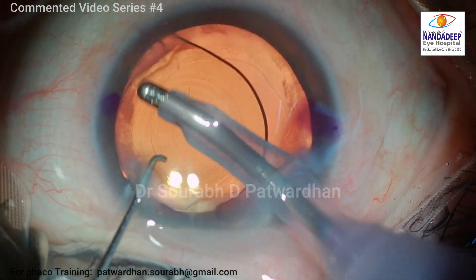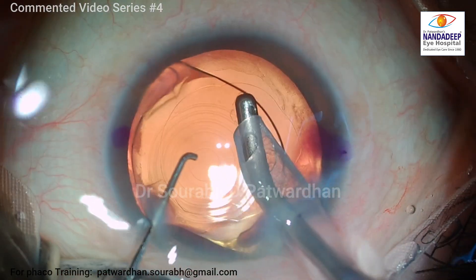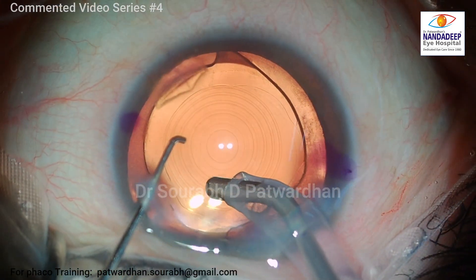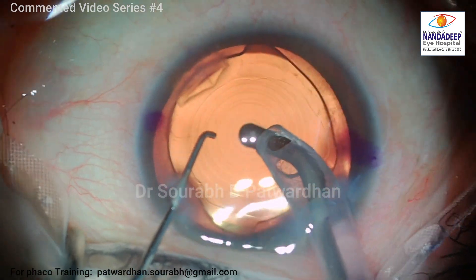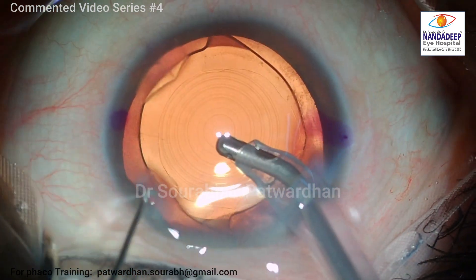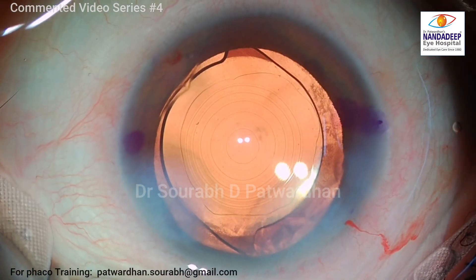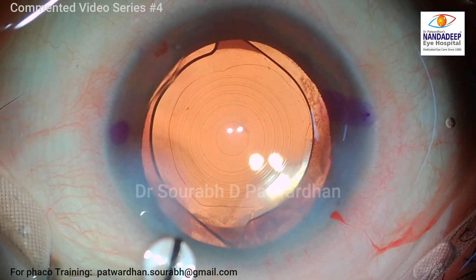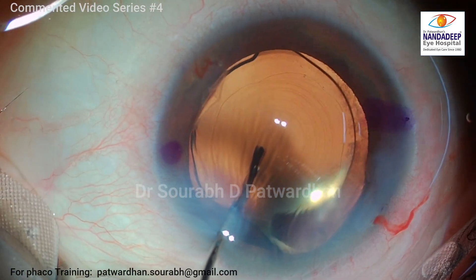I am not a polisher of the anterior capsule much because I want the anterior capsule to fibrose as early as possible and stabilize the IOL in the bag, so I just do minimal polishing. I have already done an opposite clear corneal incision — this patient had around 0.8 diopters of astigmatism at 140 degrees, so I tackled that with the incision on the steep axis. That's why I have marked the eye at 0 and 180 degrees.